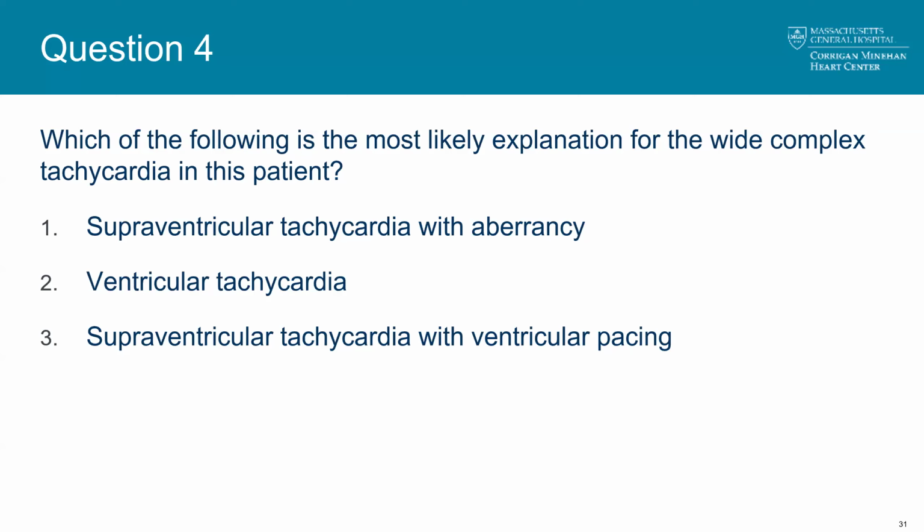So for that reason, when I'm reading EKGs, I try to do things the same exact way every single time. It means that in some cases you may go a little slower than you might have. It means in some cases that you may go a little faster than you might have. But it allows you to be consistent, meaning you'll be as efficient as you can be, and maximize consistency.